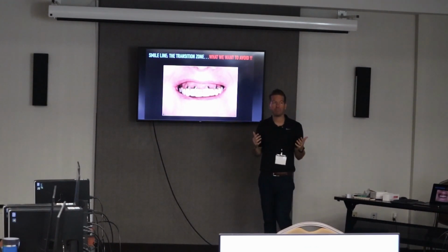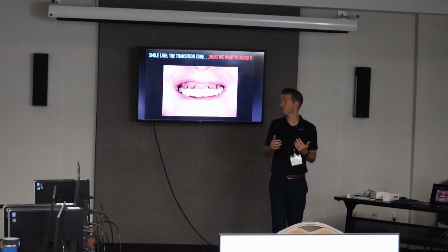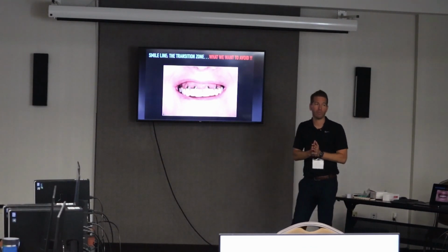A gummy smile, you're going to have to think twice, like, hey, how should I restore this case? Is it appropriate to restore this case with a hybrid? Because you just don't want to show that line. That's going to be a really bad day. And how do you revert from that? It's really tough.